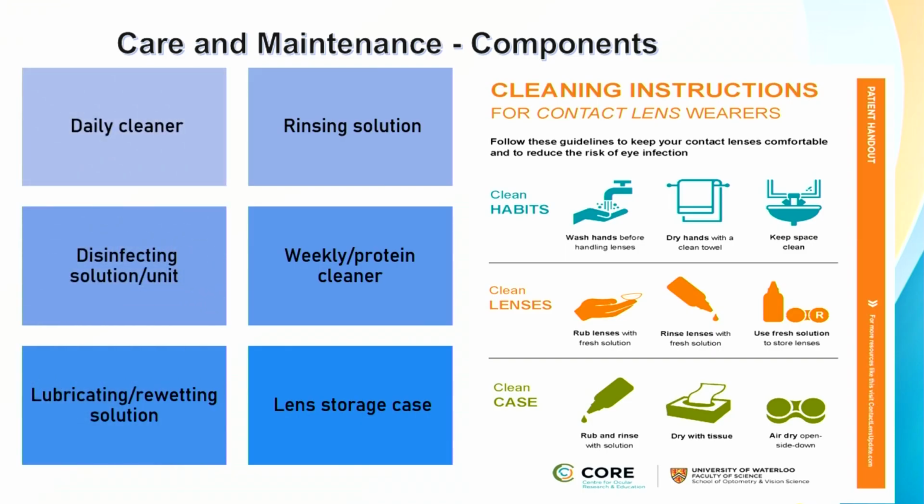So care and maintenance has a few components. It's not just the solution which we use to clean the lenses. The one bottle solution contains all these things in it. So it's a daily cleaner where we just clean the lenses and remove the dirt, and rinsing solution as well, and disinfecting solution. Any contact lenses have to be disinfected.